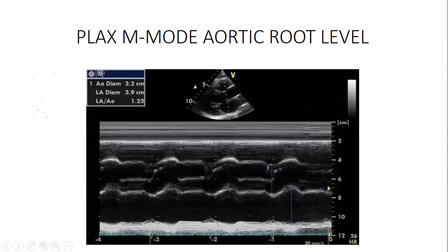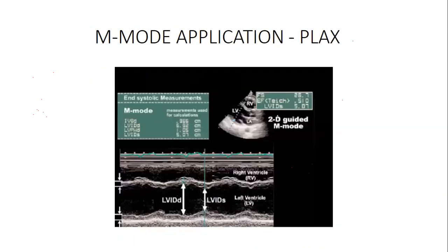The rest we'll explain as we move on. I'm just trying to emphasize the point of M mode on long parasternal axis. You can see now they have just shifted the scan line from the aortic root to now where? Your job is to know which anatomy I am cutting. So in this case now, we are cutting the long parasternal axis at a very different level. Now, which level are we?